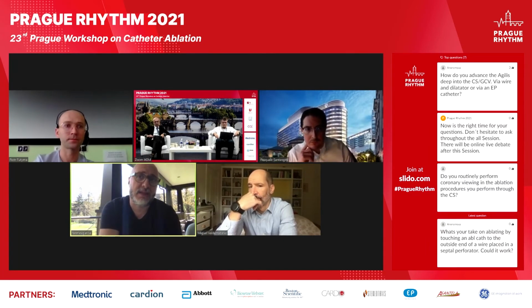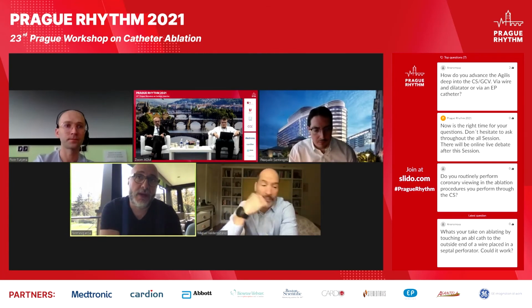I think that's probably going to be the best option in the future, because you limit the damage on the tissue and you can limit the size of the lesion to the perfect spot. So I think that's where we're going in the future, hopefully. But at this point, I am not aware, I don't know if the other presenters are aware, but it's not clinically available. There is no way to deliver RF right now for patients.